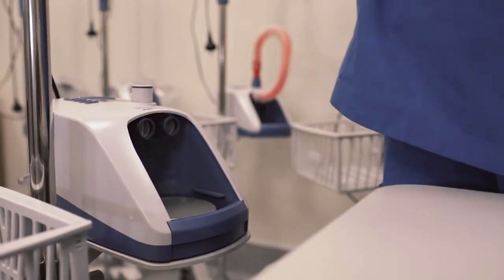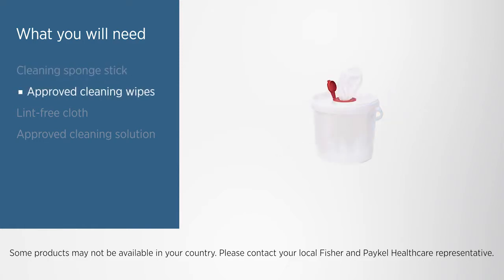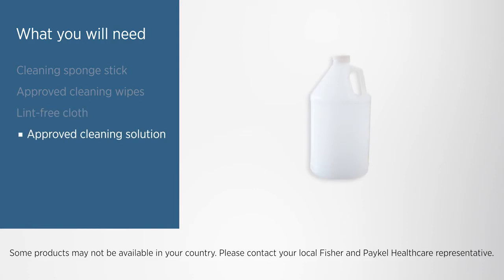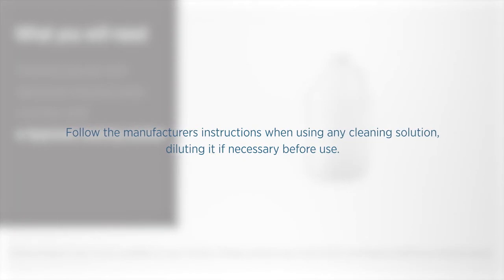For cleaning you will need a cleaning sponge stick, approved cleaning wipes, a clean damp lint-free cloth, and an approved cleaning solution. Follow the manufacturer's instructions when using any cleaning solution, diluting it if necessary before use.